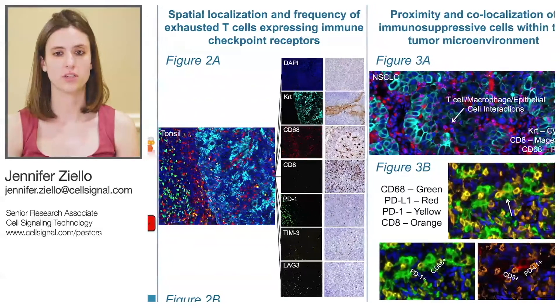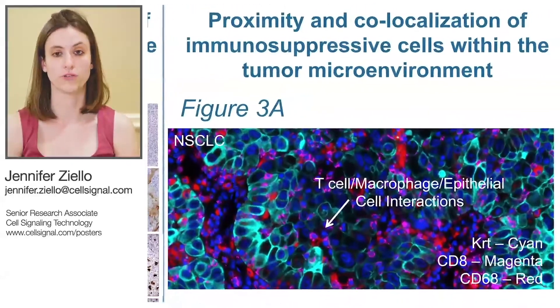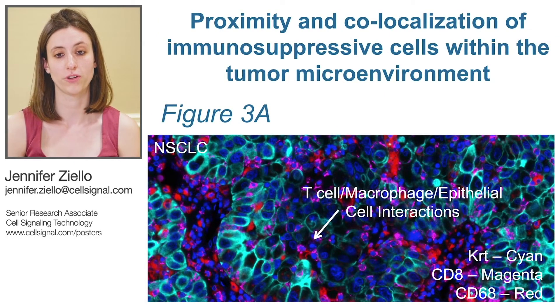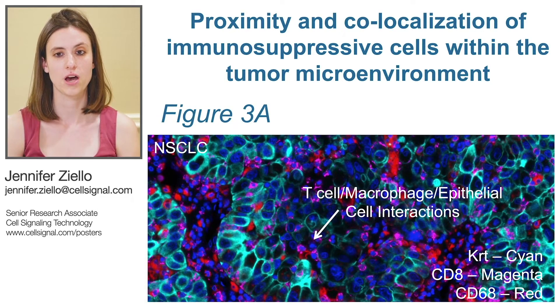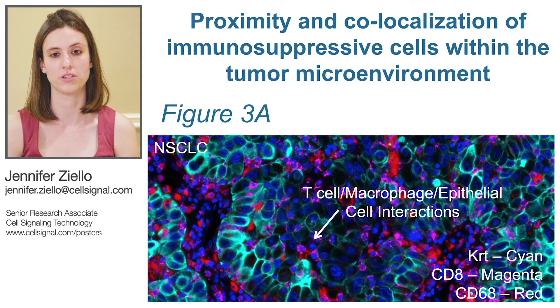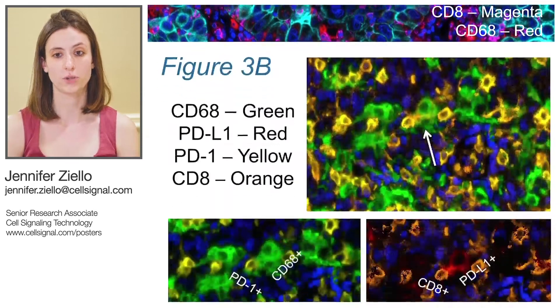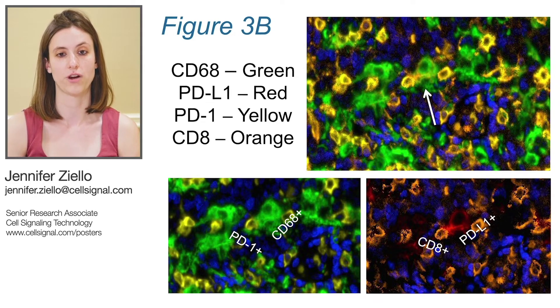This is a great way to break down an initially chaotic appearing image and utilize the information present in order to glean meaningful information. With multiplex images such as these, you can also glean proximity information in addition to co-localization and frequency data. For example, in the same non-small cell lung carcinoma section, shown in Figure 3A, you can see red CD-68 positive macrophages, along with magenta CD-8 positive T-cells wedged right up against cyan cytokeratin positive tumor cells in many cases. We can also visualize CD-8 positive PD-1 positive T-cells in close proximity to CD-68 positive PD-L1 positive macrophages that may be indicative of interaction.